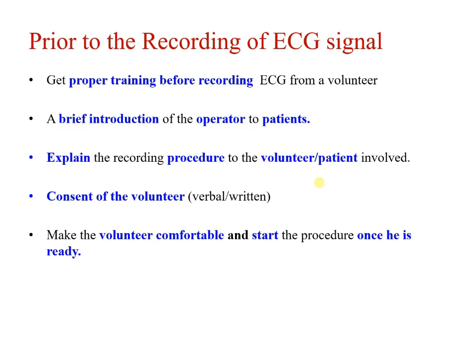The second most important thing is to make the patient comfortable, because in most cases, when we hear about some experimental or clinical procedure, we panic, or visualize that there must be some seizure, some injection, some operation, and it may initiate stress. So before doing your recording, you must give a brief introduction of yourself, who you are and what your role is in the whole process.